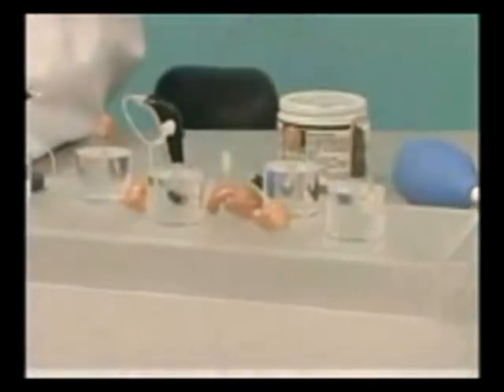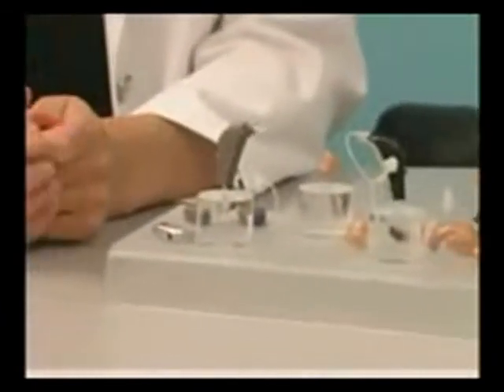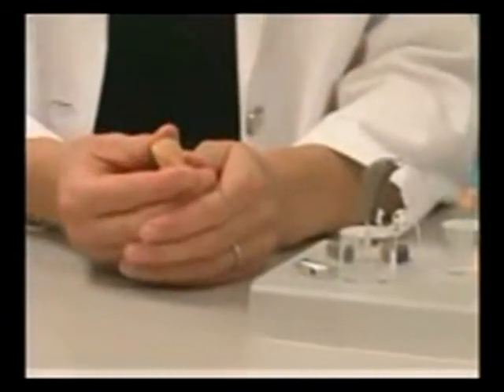In the 1980s, digital technology first became available in hearing aids, and it didn't take off right away because initially it was too large. But as miniaturization of the digital components improved, digital hearing aids have become the norm now, and most companies are discontinuing their analog hearing aid lines.